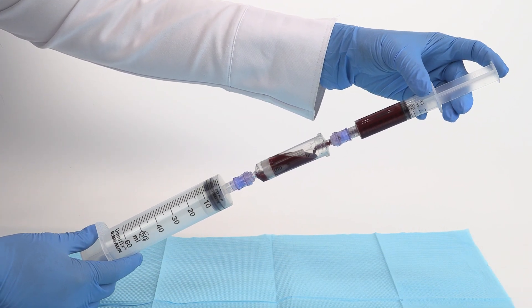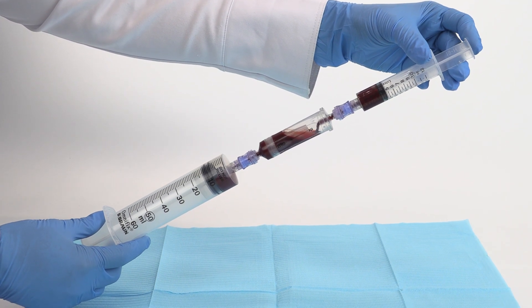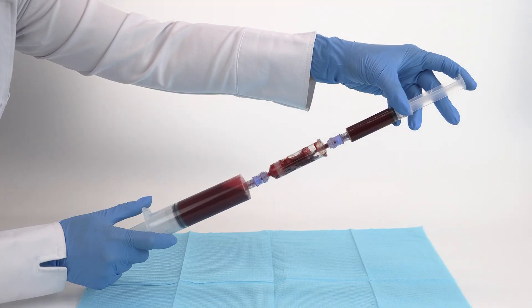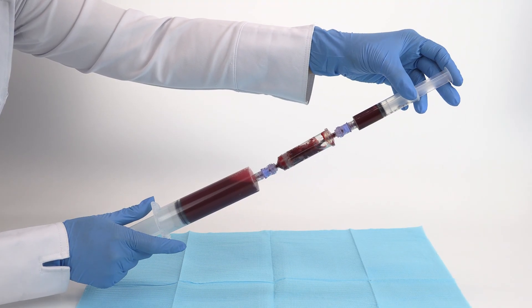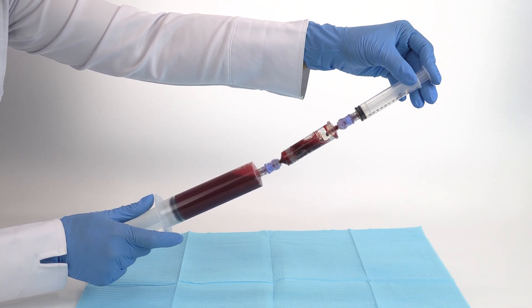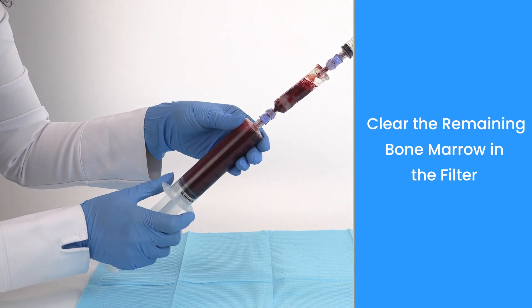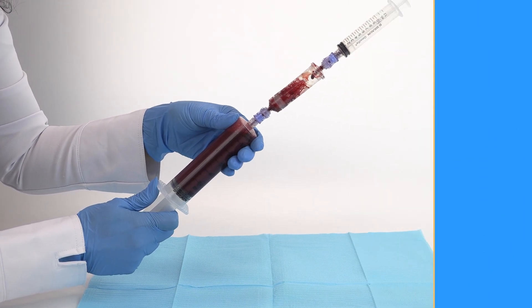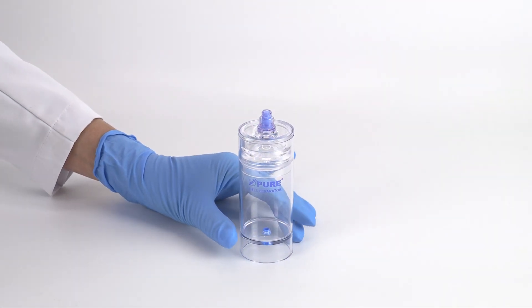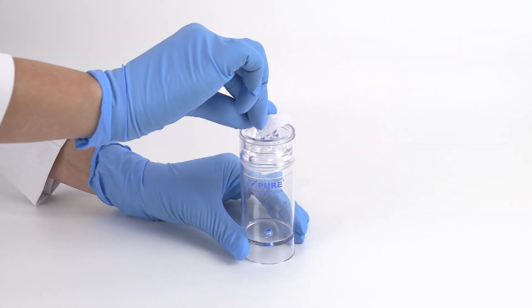Connect each 12 milliliter bone marrow syringe to the import of the bone marrow filter, then connect a 60 milliliter syringe to the outport of the filter. Filter by injecting the bone marrow from each 12 milliliter syringe through the filter into the 60 milliliter syringe. As a reminder, always swab the needleless ports with sterile alcohol before and after accessing with a sterile syringe.